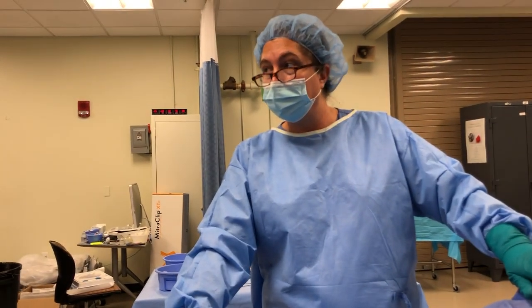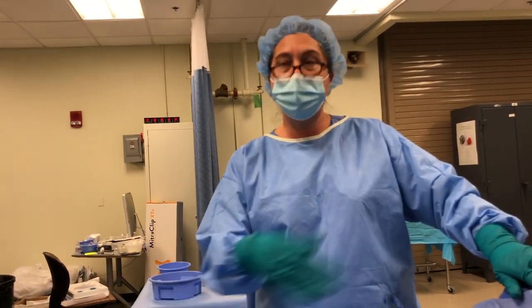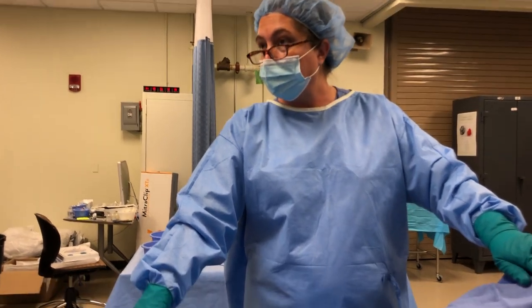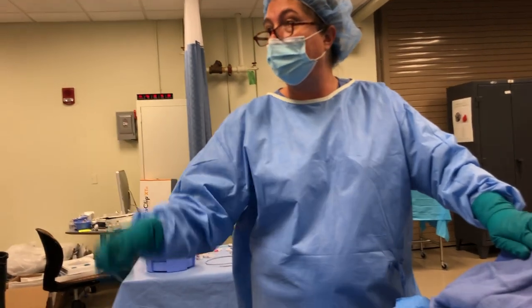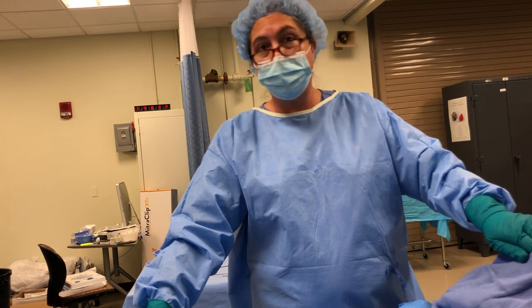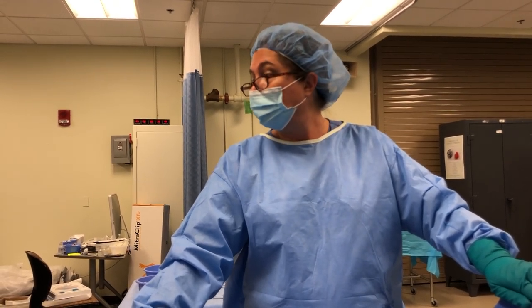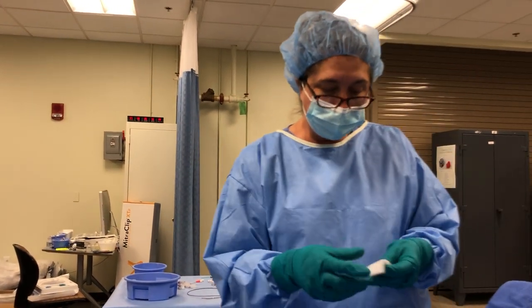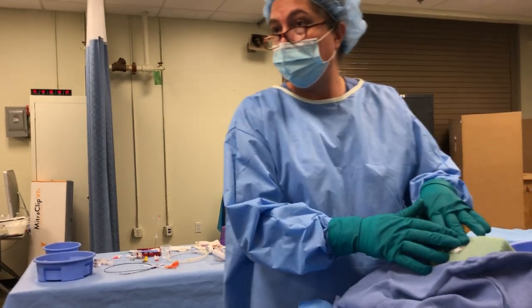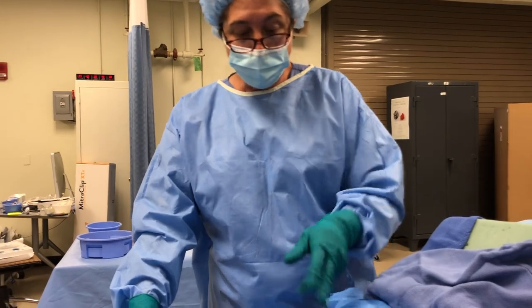At this point we would have already finished whatever else we were doing — this would be the last step. The doctor determines we don't need to leave it in and says pull it. They may pull it, or they may tell me to pull it out. They'll break scrub and say wait 15 to 20 minutes, get an echo, make sure there's no more effusion and they're not building up again, then go ahead and pull it. Put a little bandage on — very similar to pulling a sheath — a little Tegaderm or big Tegaderm, whatever you want to use, and get them out.